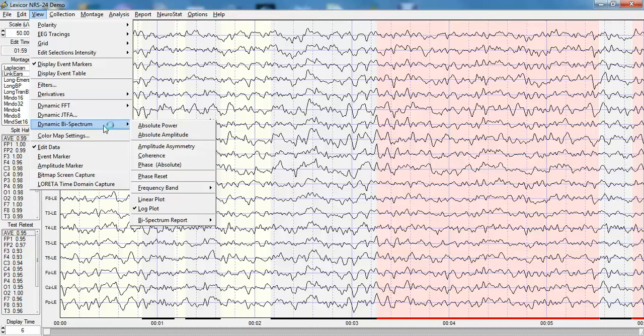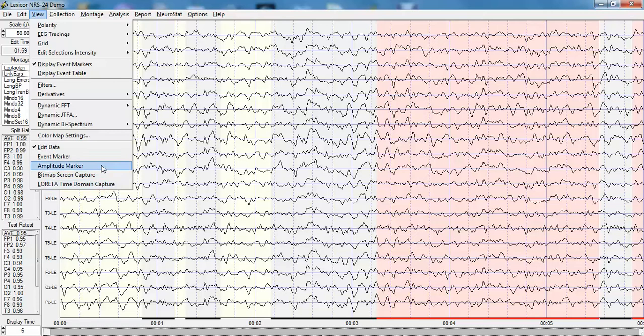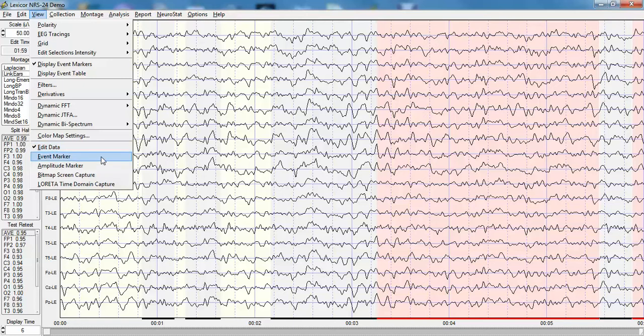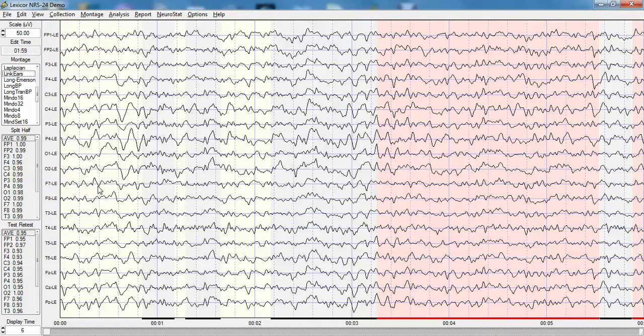Color map settings are available here, and this set of options below controls how the mouse behaves, how the keys behave, which you can go to an event marker, you can also evaluate the amplitude, you can do screen capture, you can launch a three-dimensional imaging routine.